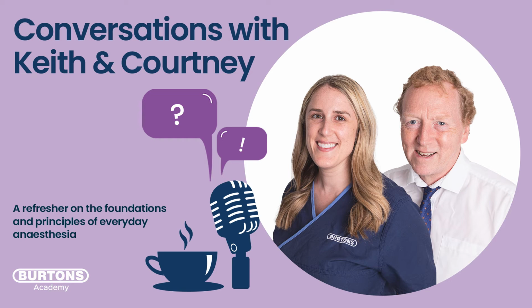But that waveform then tells you the character of that ventilation and how well that animal is able to breathe in and out. And there's more information there. If we had, for example, a poorly set up T-piece system, we all know that the fresh gas flow on a T-piece should be set to 2 to 3 times minute volume.